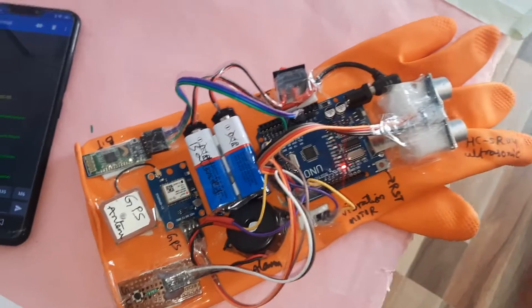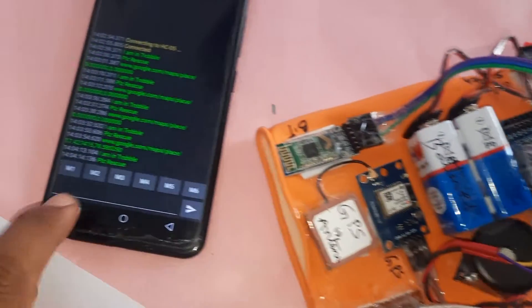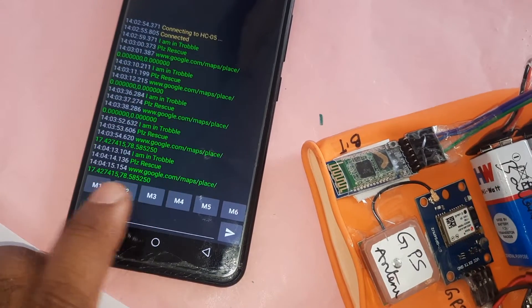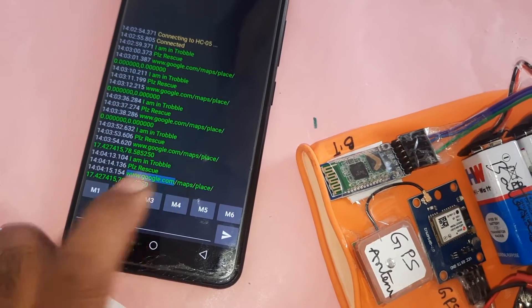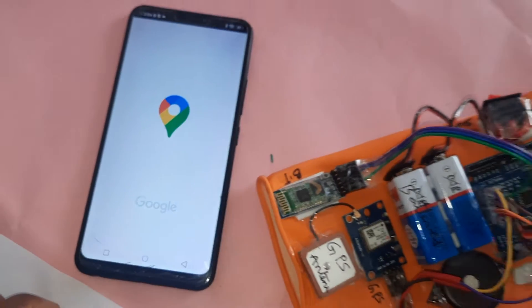Whenever any obstacle is detected, the vibration turns on. You can then press the button and it sends 'I am in trouble' with the latitude and longitude values. Click the URL, go to Google Maps search, and the map will open showing your location.